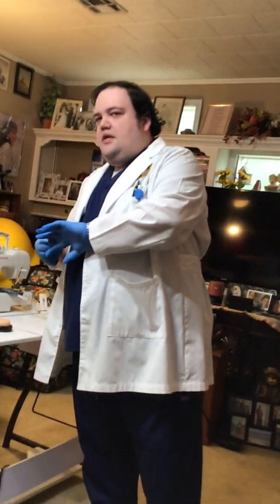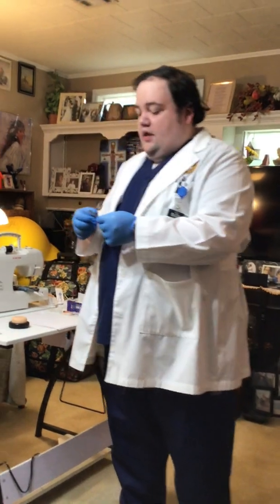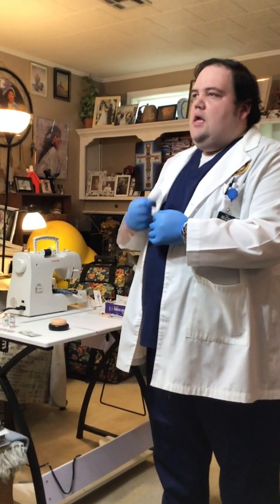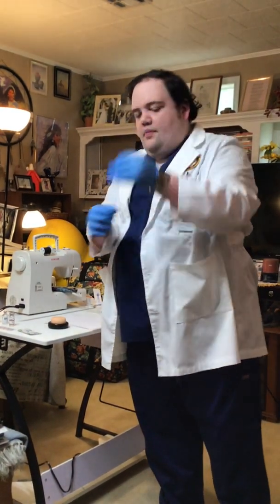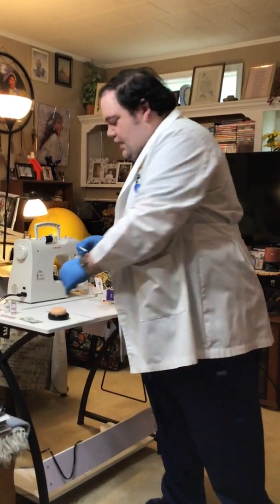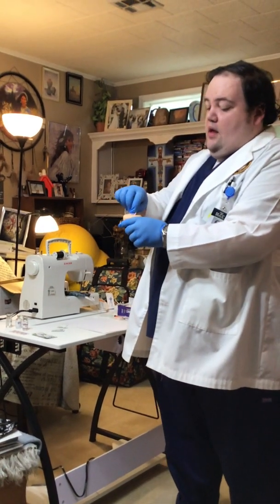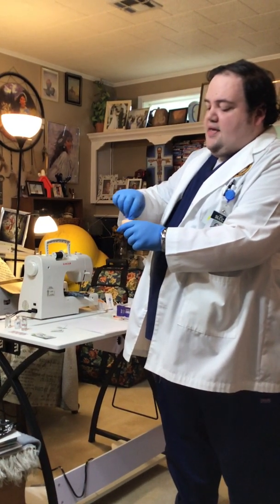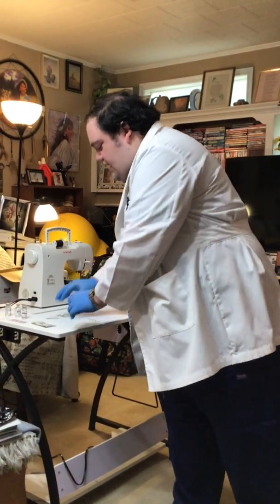Now, insulin is subcutaneous, all right? And what we're going to do is we're going to give him a shot in the back portion of his arm right here. And so let this demo pad represent that. And we're going to swab that area of his arm. We always go inside to outside. Okay? And we're going to let it air dry. We don't blow on it. We don't do any of this because that's going to contaminate.